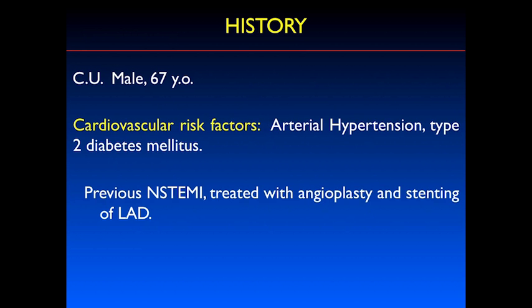The case of today is a case of a 67-year-old gentleman with arterial hypertension, diabetes, and previous non-ST elevation MI that was treated with angioplasty and stenting of LAD. The patient was referred to our hospital for a new acute coronary syndrome.